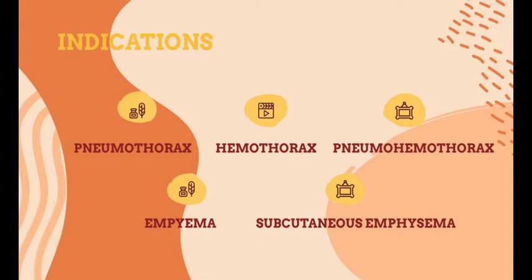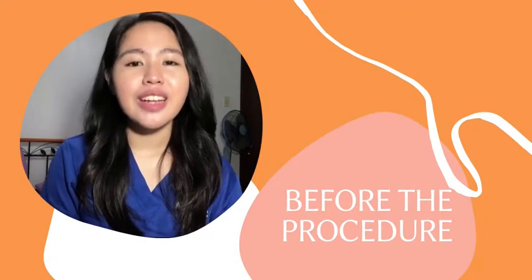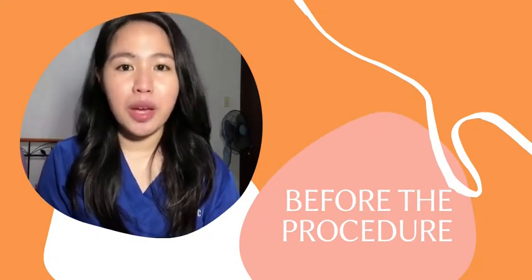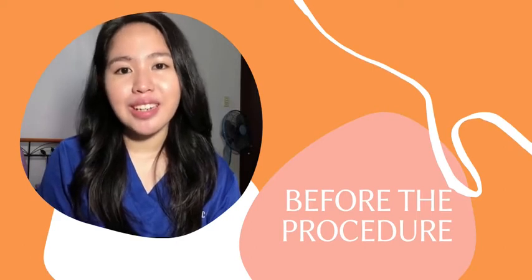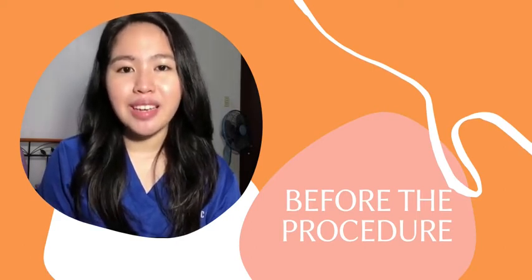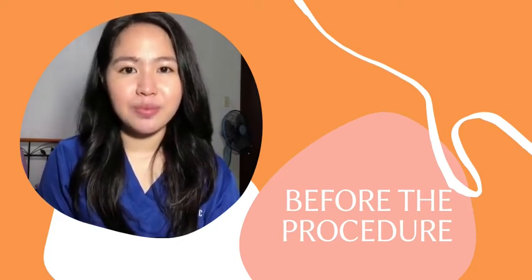Before we begin the procedure, it is important that we introduce ourselves to the patient, obtain consent, prepare the materials needed, do proper drapings, and prepare the anesthesia.